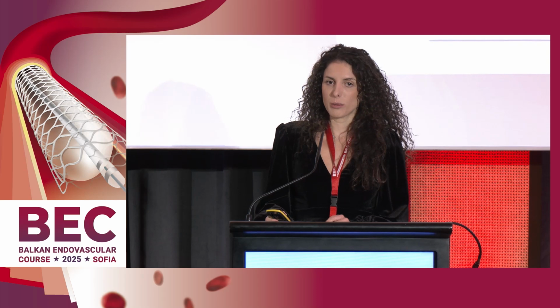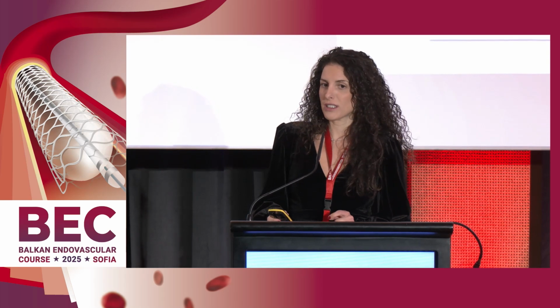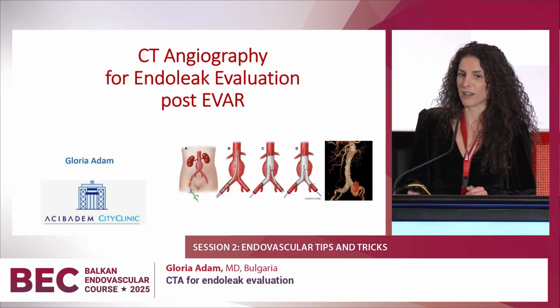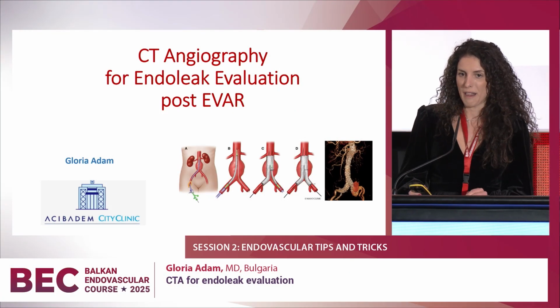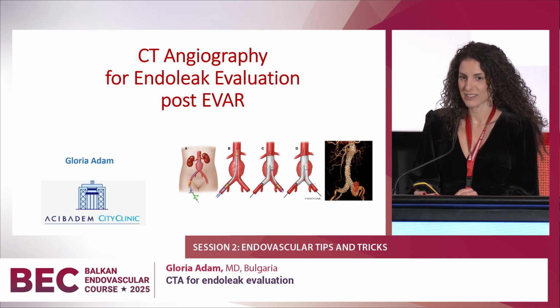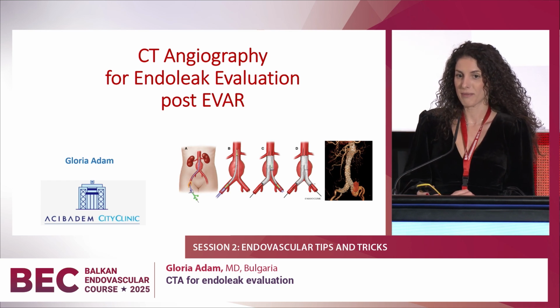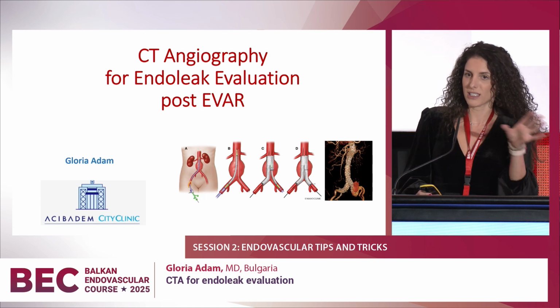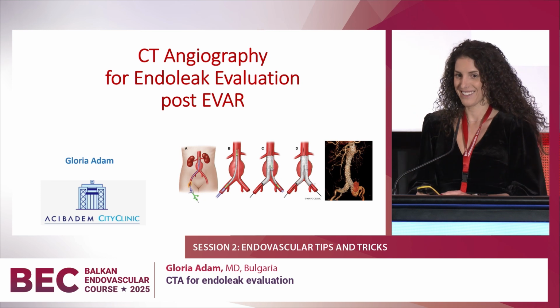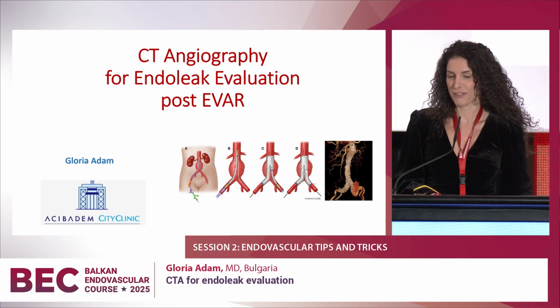And related to the previous topic, I'm not sure that in the software of the MRI we have functional MRI. About your recommendation, I'm not sure we have it. We'll be able to acquire the sequence and do the post-processing later. Maybe, but I don't think that they have ever done it there. I'm not in that center where Dr. Polomsky is. Okay. Yes, Philips.